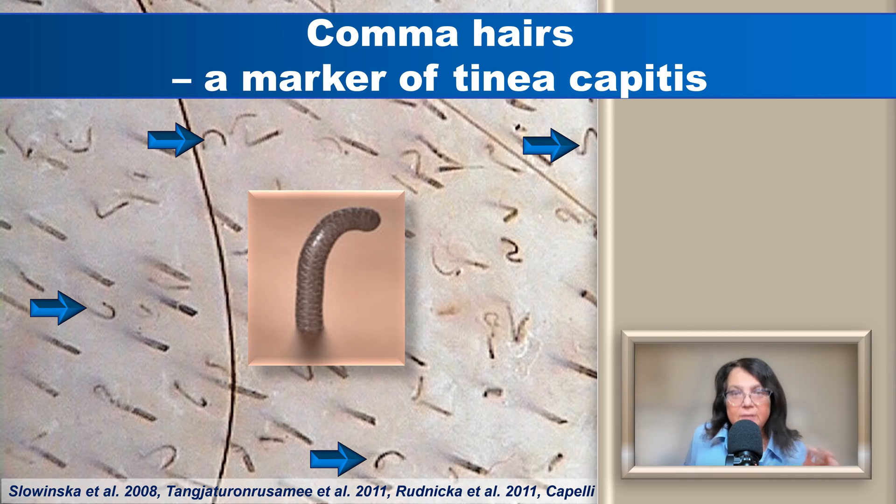This is an example of a field of view full of comma hairs. A single comma hair is not sufficient to suspect tinea capitis. However, if we have multiple comma hairs in one field of view, this is sufficient to make the initial diagnosis of tinea capitis and to start treatment. We will always perform mycological culture to confirm the diagnosis and, most importantly, to identify the pathogen.